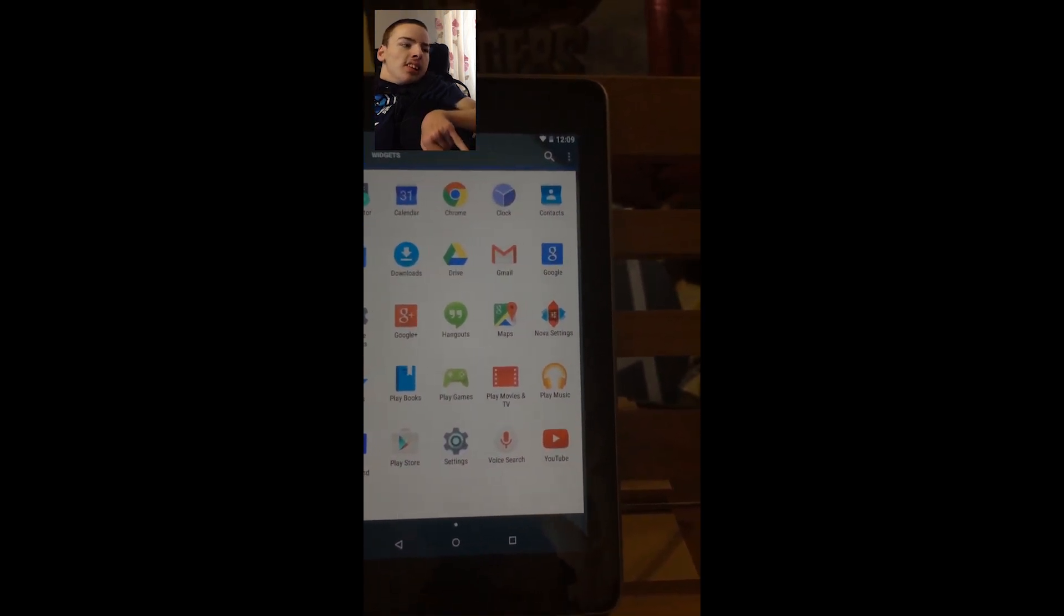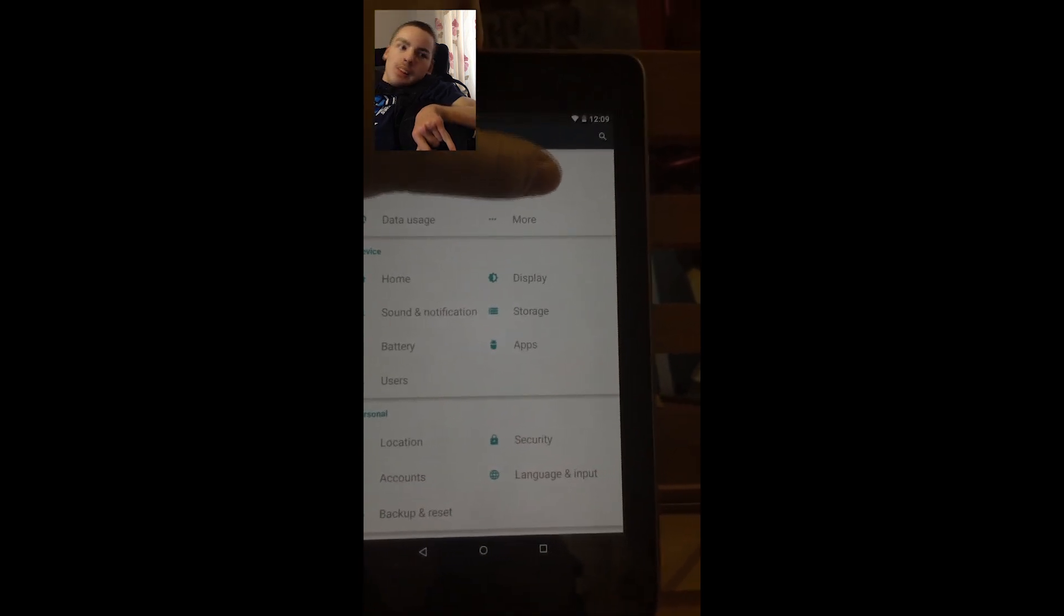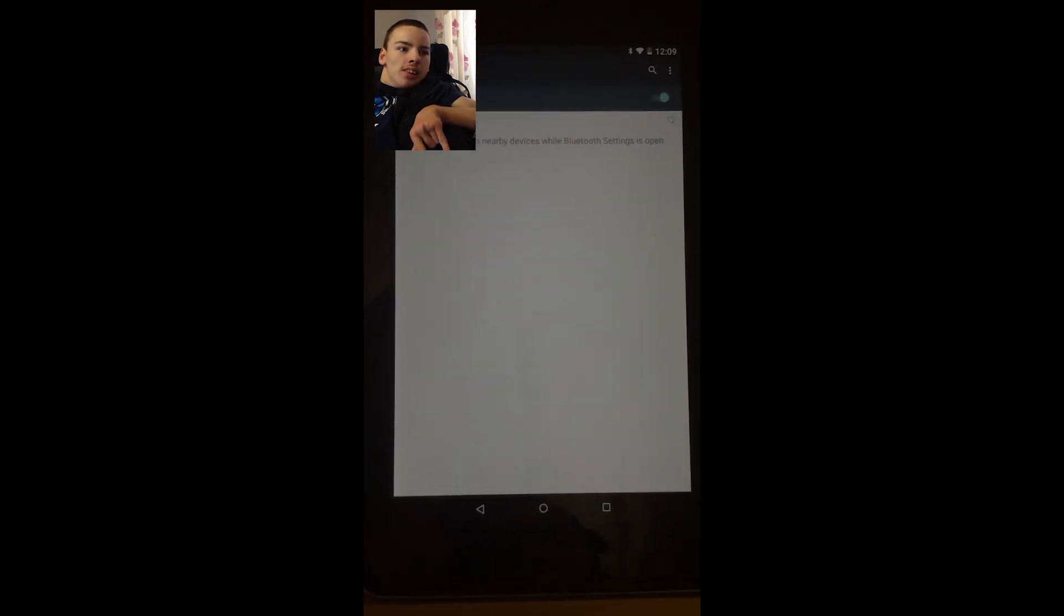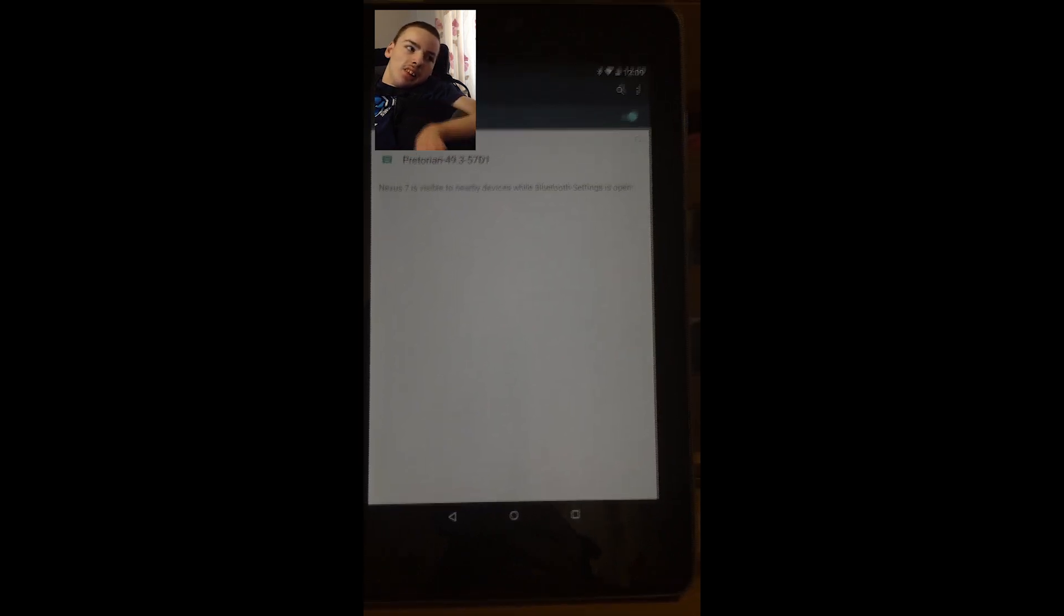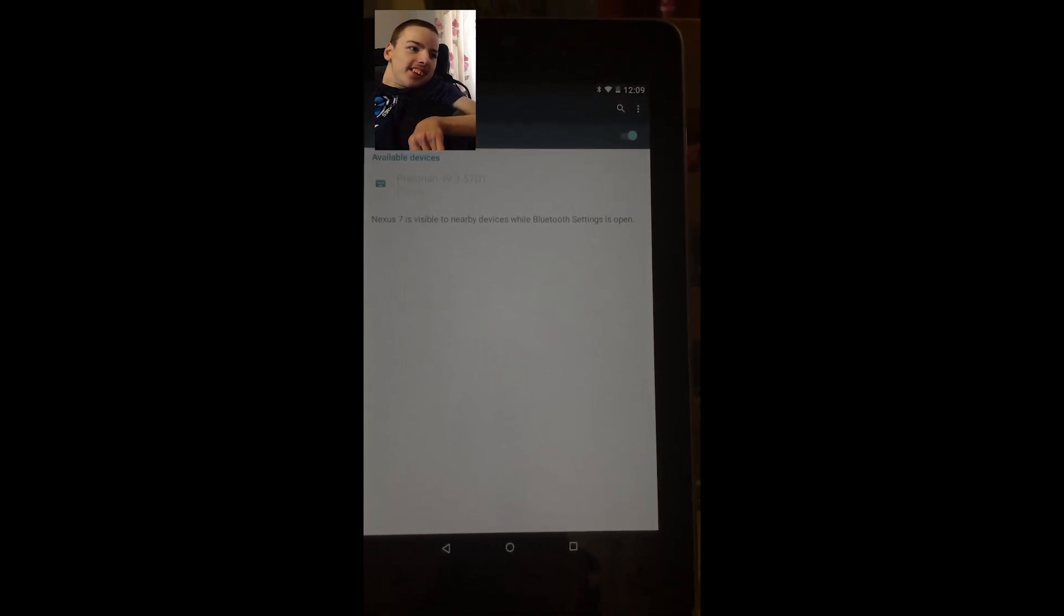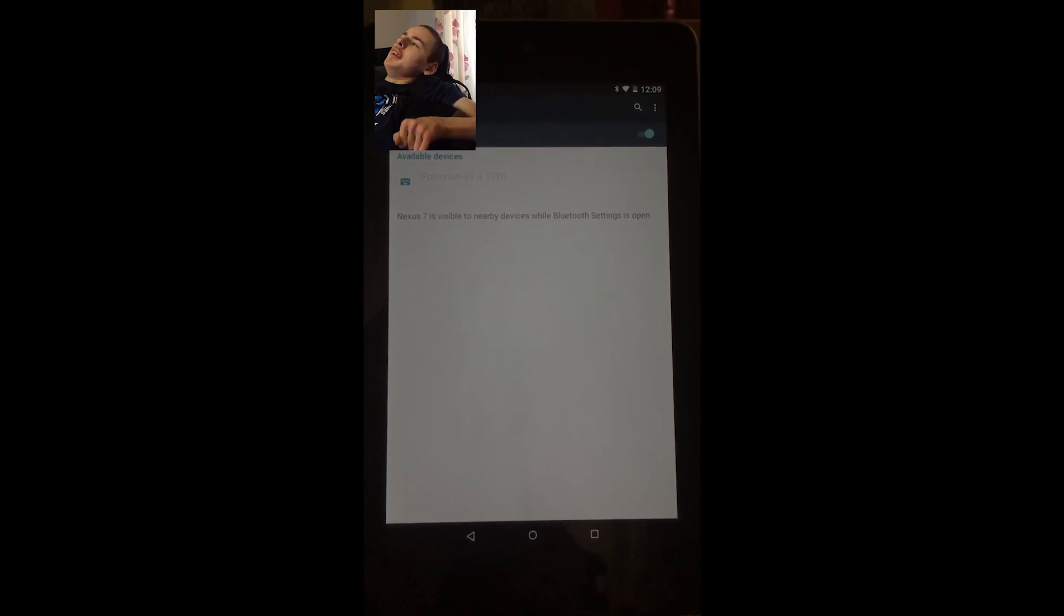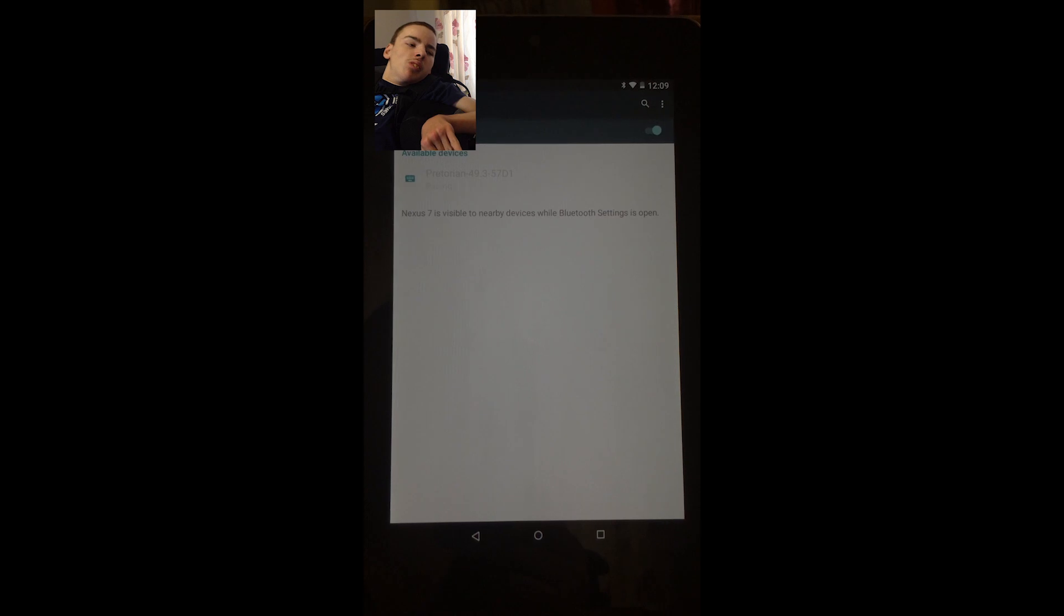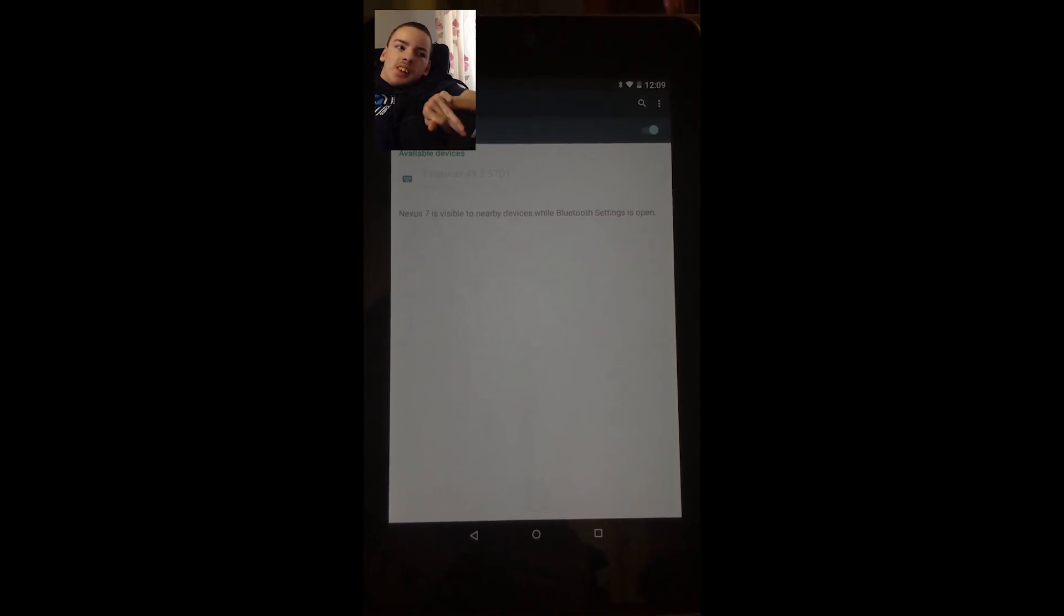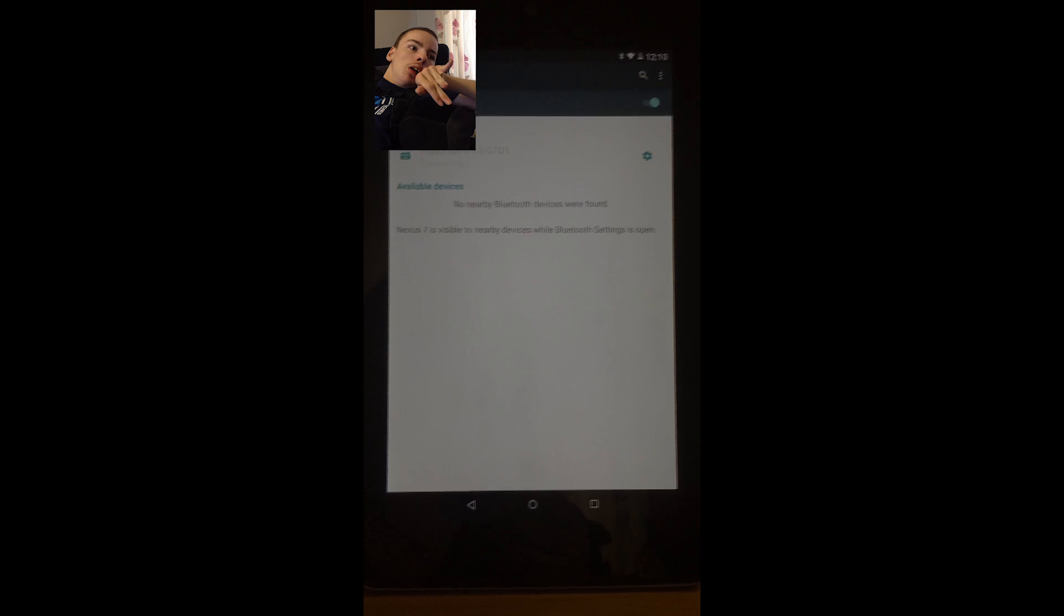So we'll go into your settings. This is a Bluetooth device, so we've got Bluetooth. Switch Bluetooth on and hopefully this should now find our Praetorian applicator. There it is. So we select Praetorian. Right, that's now connected.